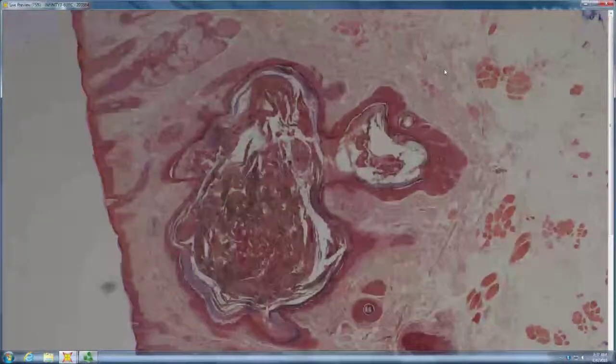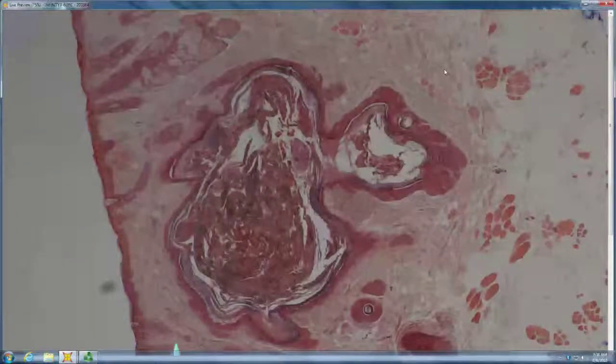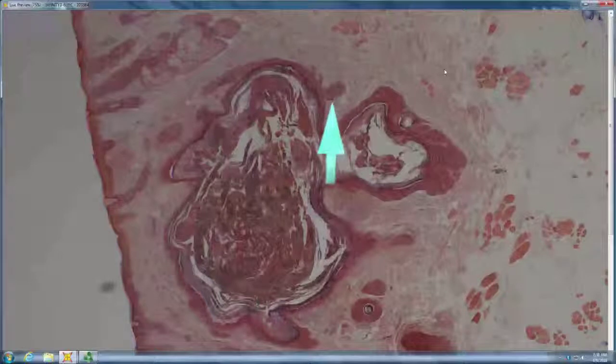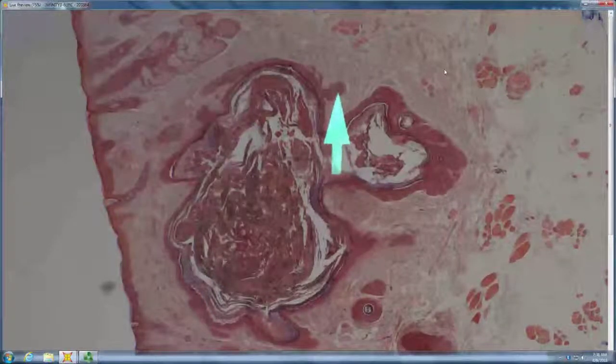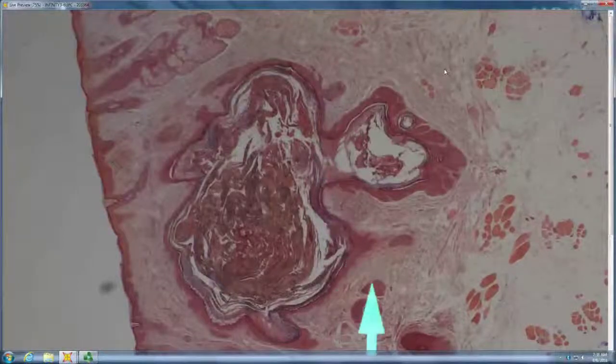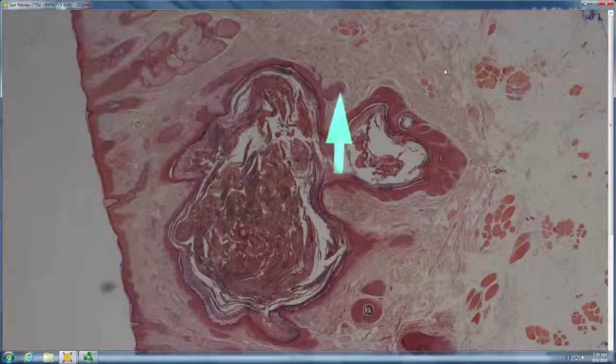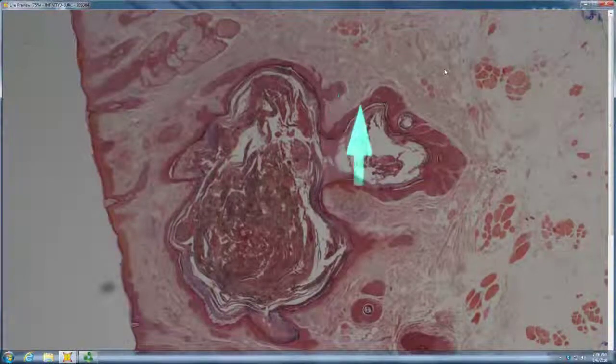Okay, so Shirley, what do you think? Looks kind of like a cyst, and then radiating from the cyst are tiny little follicle-like fingers. Trichofolliculoma. Yeah, if they are fully formed follicles, it's a trichofolliculoma.